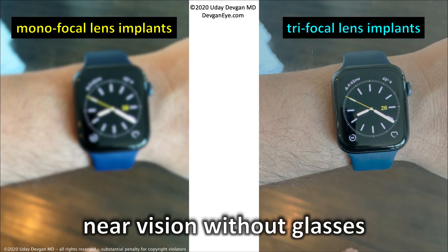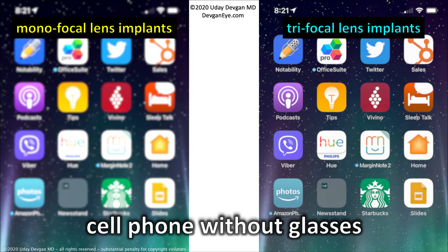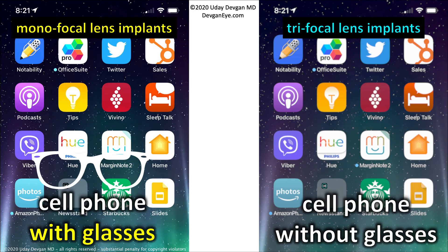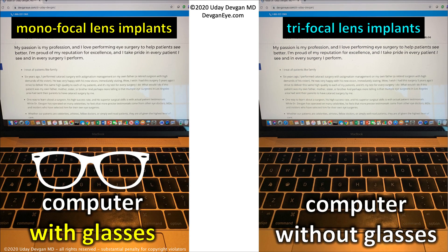Here's the advantage of the trifocal lens implant. With the monofocal giving great 20/20 distance vision, that's about how your wristwatch looks without glasses — blurry. The trifocal lens allows you to see your wristwatch without glasses. We can remedy this by having you wear glasses for the monofocal lens implant, and the image improves dramatically with reading glasses. The same applies for your cell phone: blurry without glasses with the monofocal, but the trifocal lets you see either way. For a computer image, the monofocal won't be super clear, but the trifocal will be great.